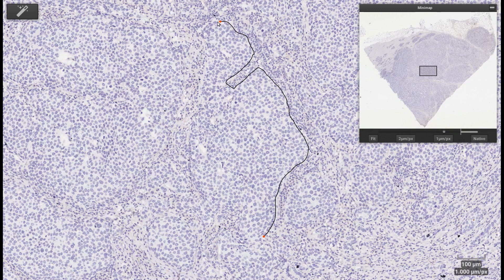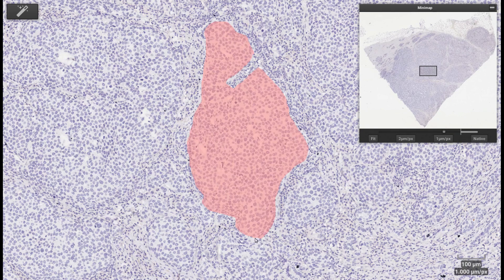Here we show the quantification of IHC-PR staining in breast tissue, which requires identification of tumor cells versus stroma cells for the scoring.